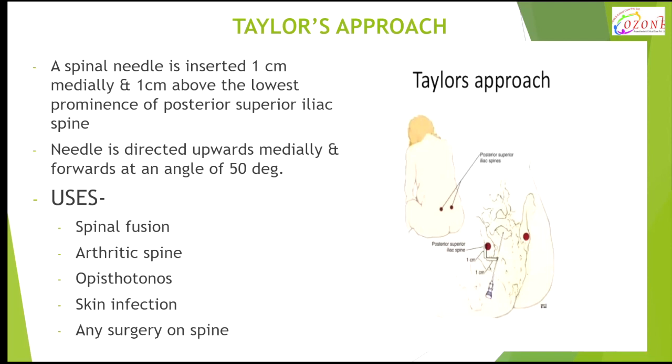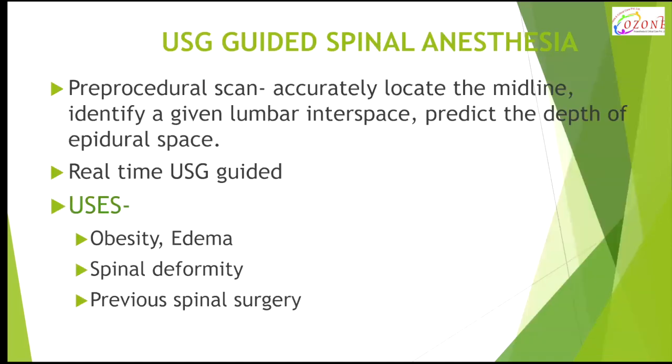Taylor's approach is used in case of spinal fusion, arthritic spine, opisthotonic position, skin infection, and any surgery on the spine. Then we will see the recent advances. First, we will see the USG guided spinal anesthesia.